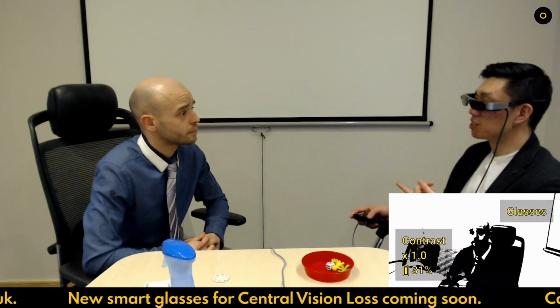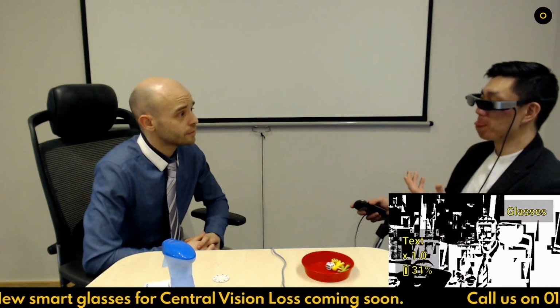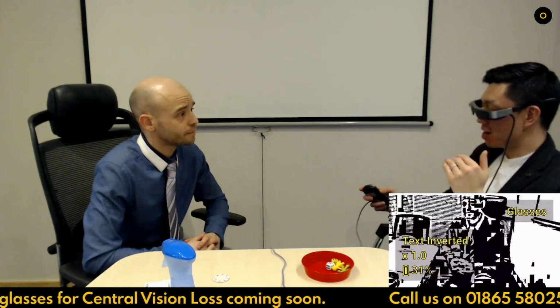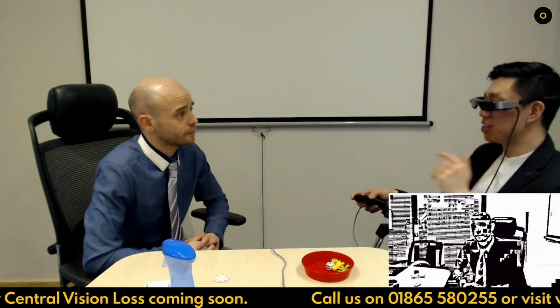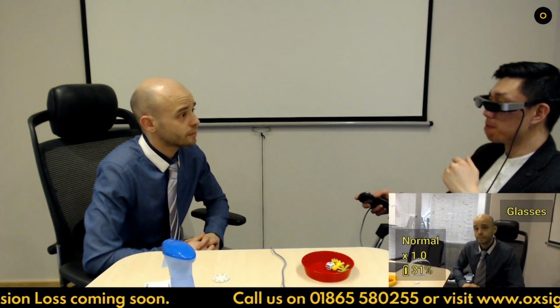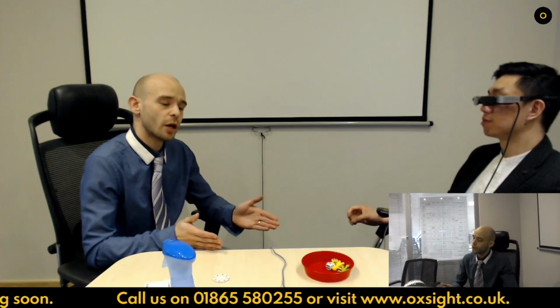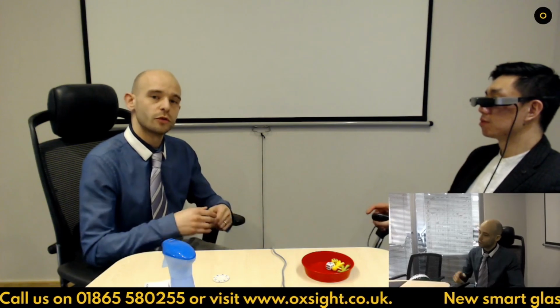Anything, you can always fine tune. And the fine tuning is exactly what it is. It's not one step, then the next step, and then following that. You control it to the exact degree that you want, and then you let go of this button and it'll stay there. So it's super handy. I think it also depends on the environment you're in, how much fine tuning you need. If you're in a very low lighting situation and you're using edges mode, you might want as much of what we call the brightest setting as possible, so that you've got little specks around things.